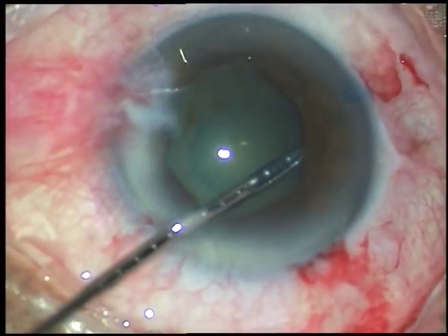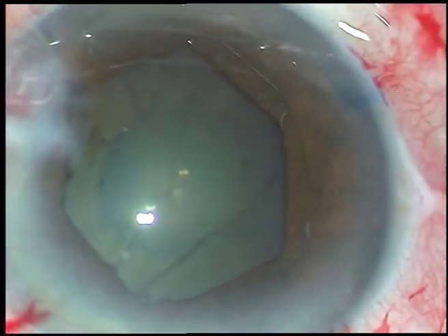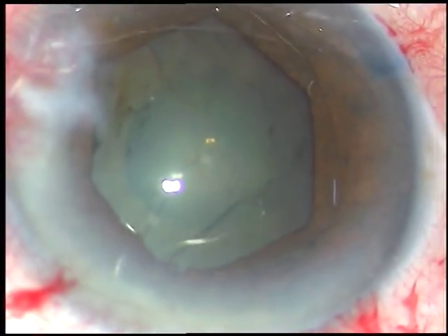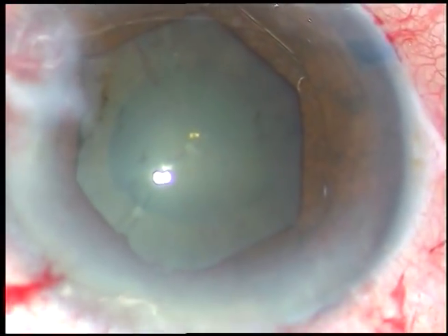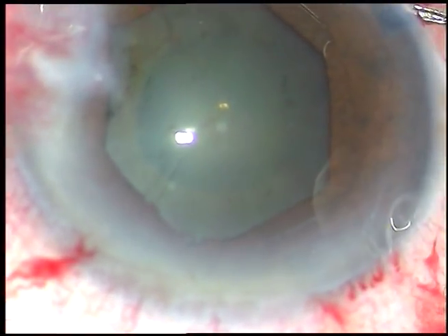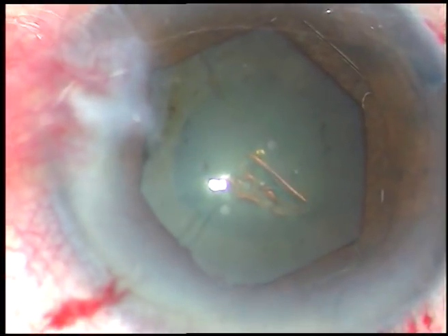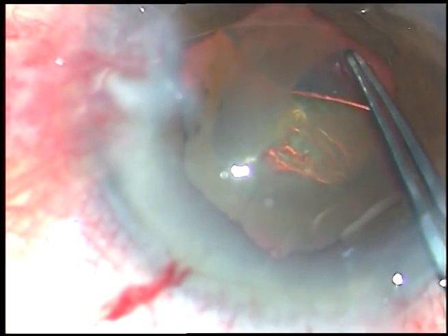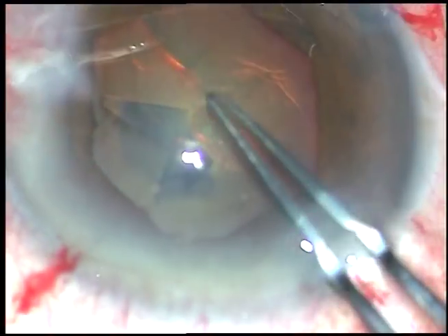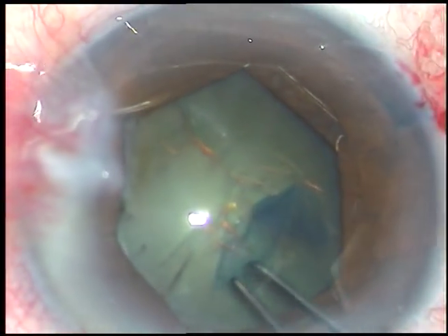Now the flange at 10 o'clock has been tucked, going through the left side port and using the left hand. This is the shape of the pupil. B-Hex means Bhattacharji hexagonal, invented by Dr. Subban Bhattacharji, and this is a hexagonal pupil expansion device — very thin profile, very versatile, user-friendly device that doesn't need any injector, and to take it out you don't need any injector either.